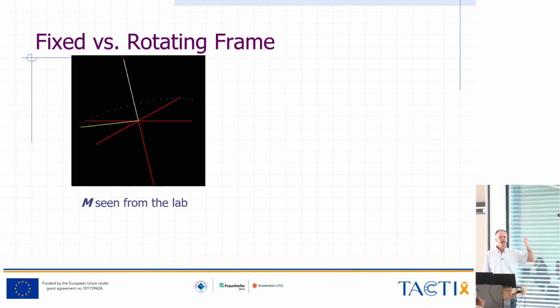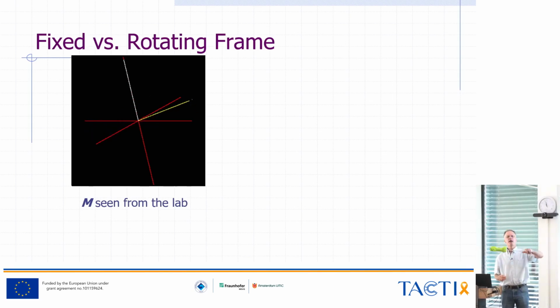But what we should see is that our magnetization is precessing, as I said before. And because this precession motion is so quick, it's easier to go into this reference center, this isocenter. If you remember, I said we could define this to be our reference. And if we do this, it means that our magnetization, which is precessing, we are now going into a different coordinate system. And the coordinate system we are now using is the so-called rotating frame, or the rotating coordinate system.